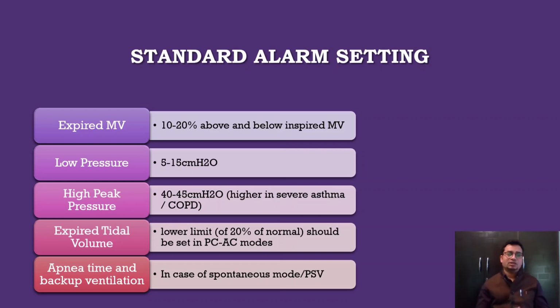Okay. Lower limit of tidal volume is usually set 20% below normal in pressure control ventilation. Low TV alarm means there is a stiff lung or maybe a leak.